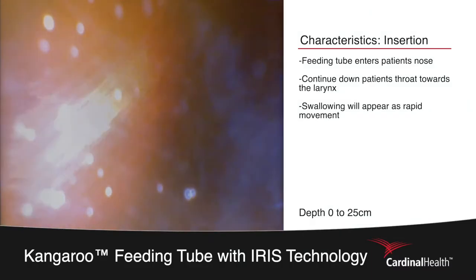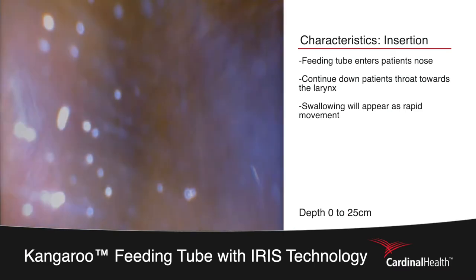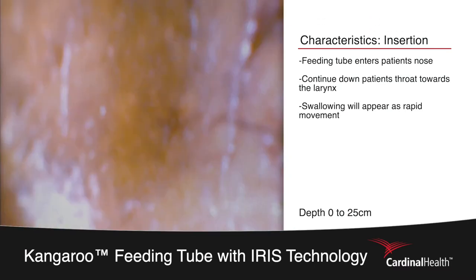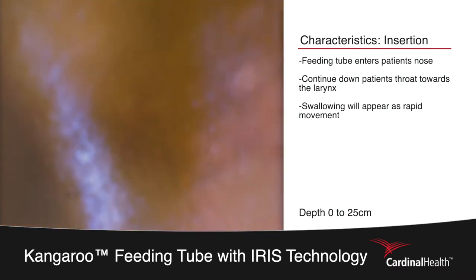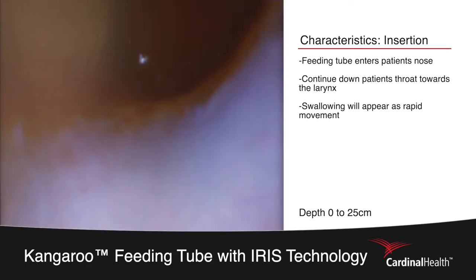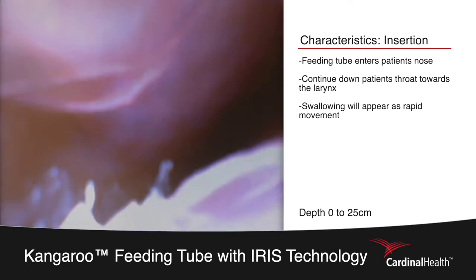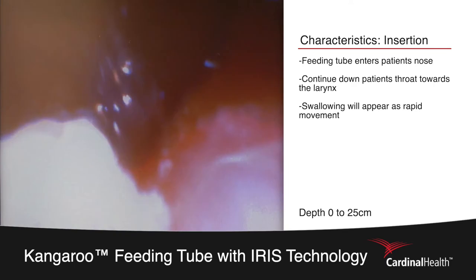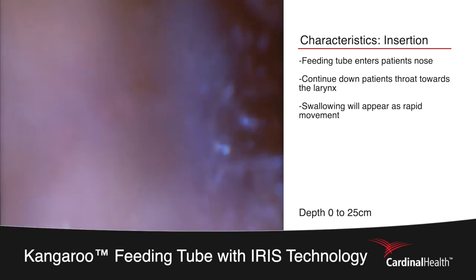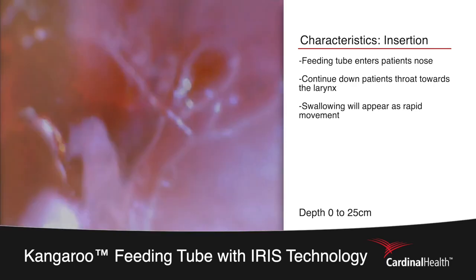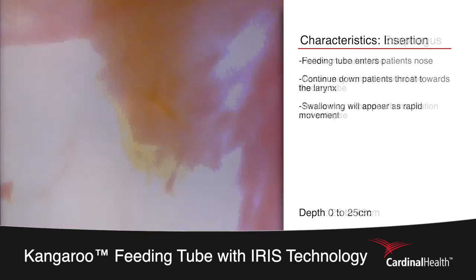The procedure begins with a placer inserting the feeding tube into the patient's nose, as can be seen here by the nasal hairs. The tube will then progress down the back of the patient's throat heading towards the larynx. The patient is swallowing, so we'll see some rapid movement as it quickly progresses down into the esophagus.